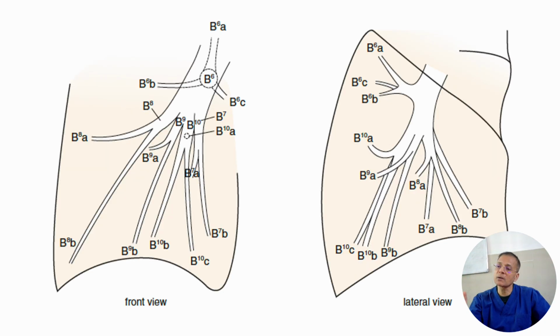So this will depict everything up to the sub-segmental divisions. You can go beyond that also, but the sub-segmental division is important. You can see this is the lateral image, this is the frontal image. B6 is written in the lateral image, so it has B6A, B6B means lateral, B6C is medial. Similarly, we can define B7, the medial basal, B8 also, B9 also, B10.